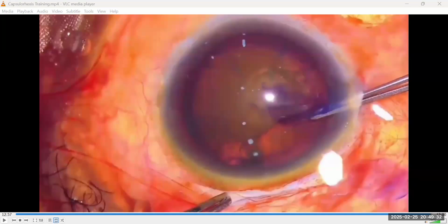We have our bent needles already. I will understand that for our rhexis. But take it back to the microscope, if possible. Take it out to higher magnification, times 16. Get your caliper and measure out 0.5. Then put it at the tip.